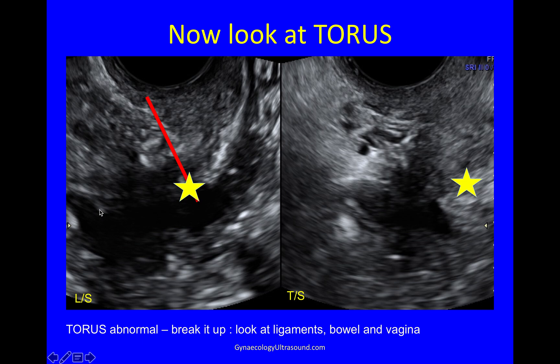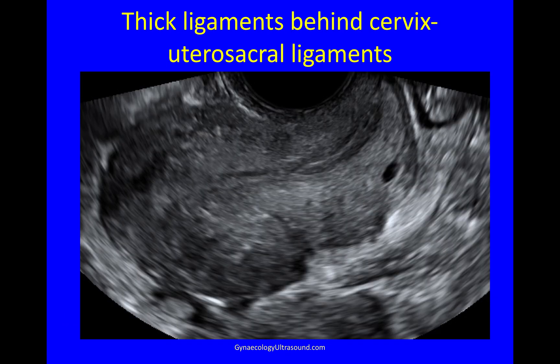So I can see the torus is abnormal. What is it? I need to break it up into ligaments, bowel and vagina. Looking at the uterus again — I'm still in the anterior fornix — here you can see the external os, the cervical canal, the internal os in a line with where the bladder attaches, and the endometrial cavity. So it's anterior wall, fundus, posterior.